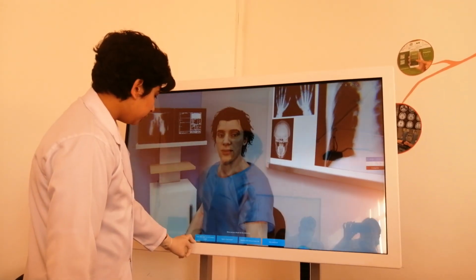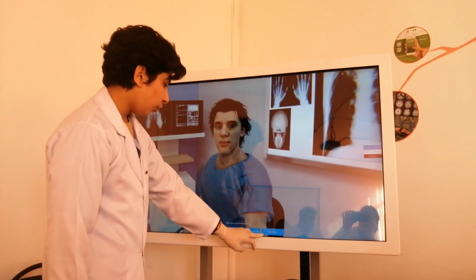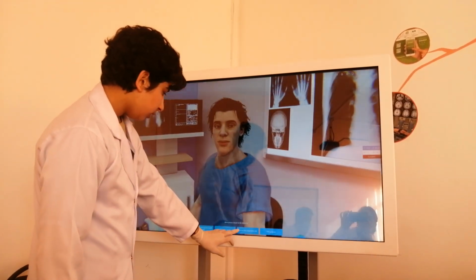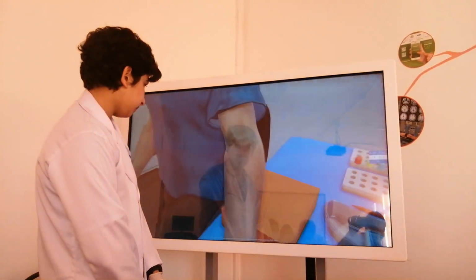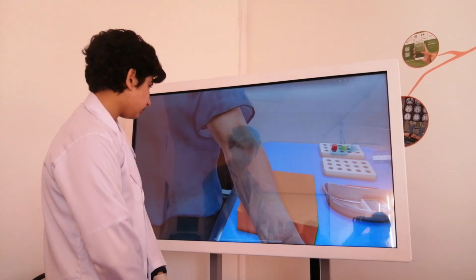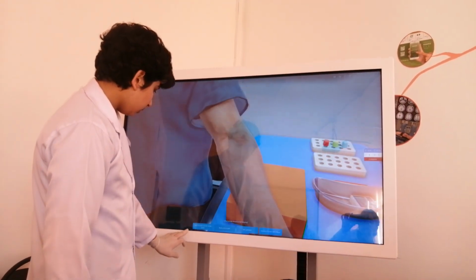Insert the tube into the needle holder. Apply a tourniquet. Examine the venipuncture site. Now we will examine the vein. Examine the site of the proposed puncture. Is it possible to inject without a tourniquet? Presence of skin rashes.